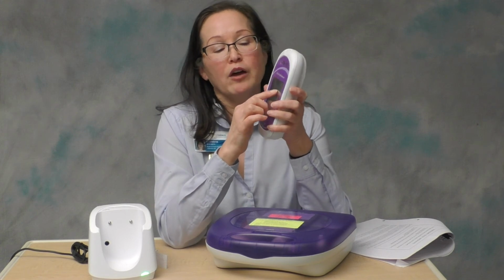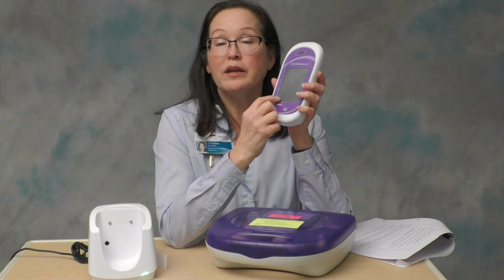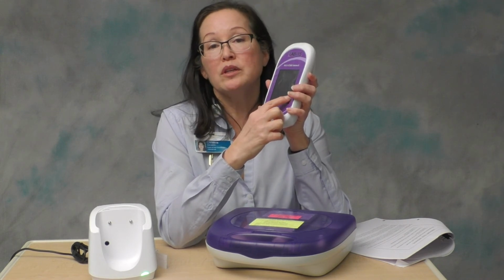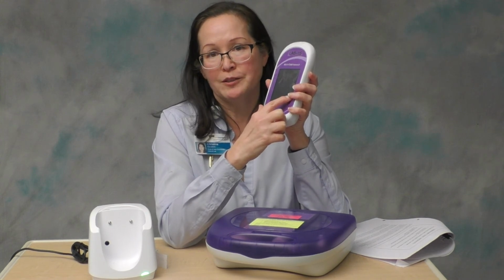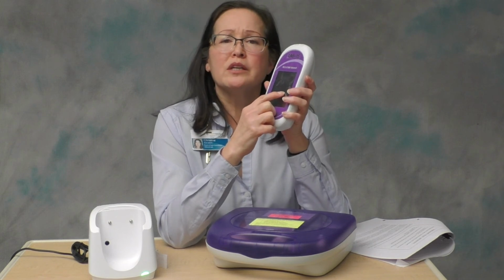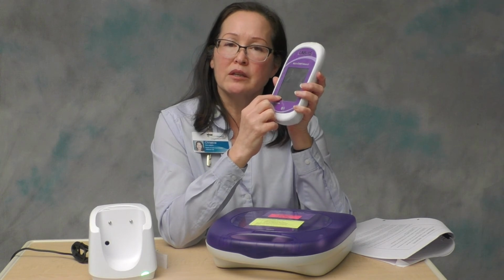When the result value pops up on the screen, you'll have either the comment bubble that you can hit or the green check mark. Once you hit the green check mark, you've accepted the result and you can no longer attach a comment. So if you realize that you don't want that result going into the patient's chart, hit the bubble comment to get the comments up and then attach that procedure error comment to it.